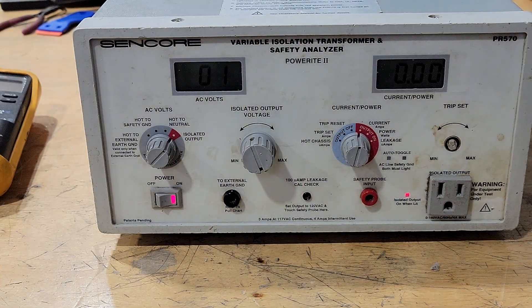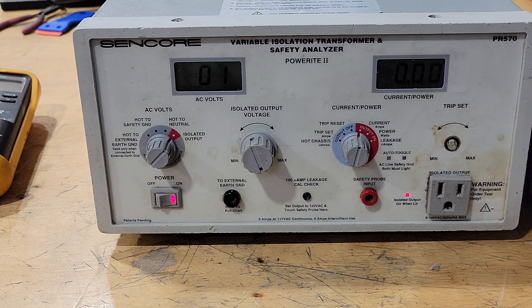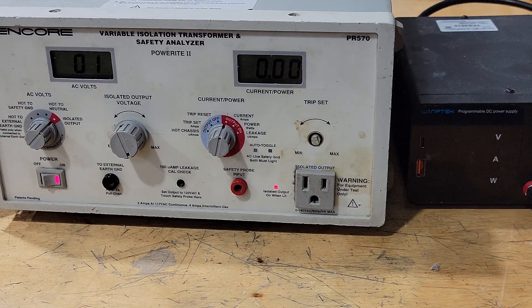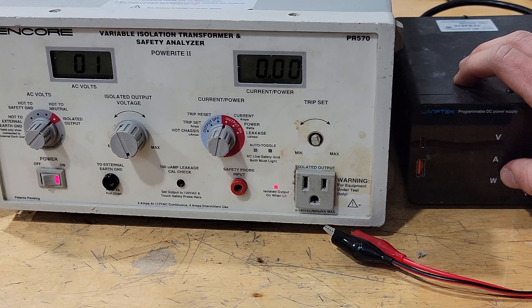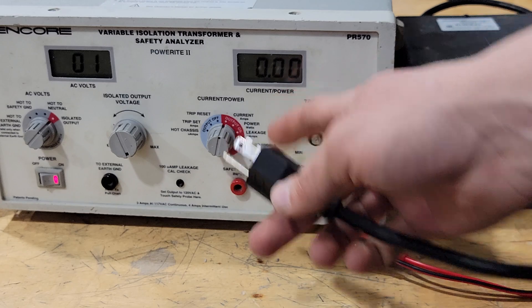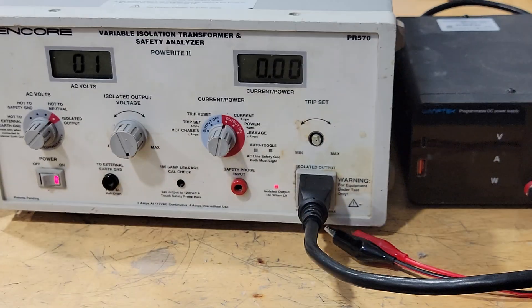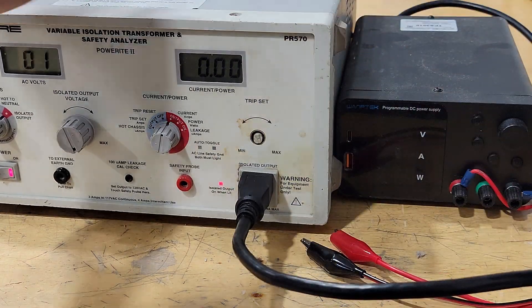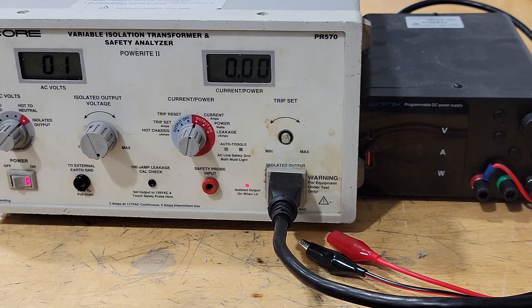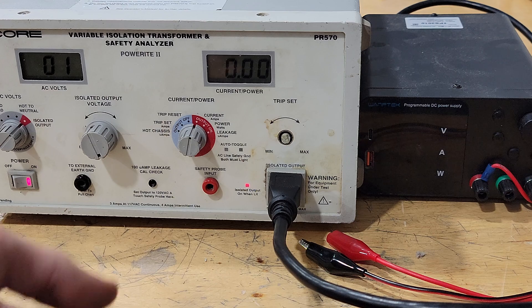To test it under an actual load, one thing I could do is plug in my trusty power supply — it has its own power readout so I can tell how many watts I'm pulling. If I attach a fan or something, I can pull a certain number of watts and compare it to the power output setting on the safety analyzer. One thing I also think is interesting is at what voltage will this programmable DC power supply — just a cheap one off Amazon — actually power on. So we'll start sweeping through.